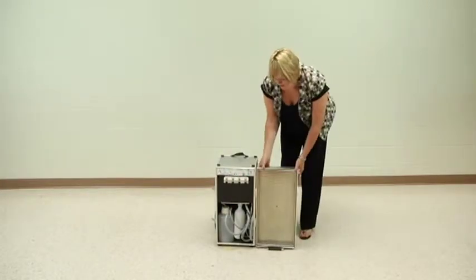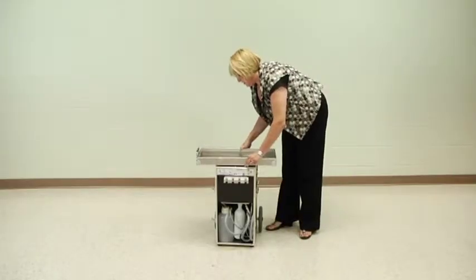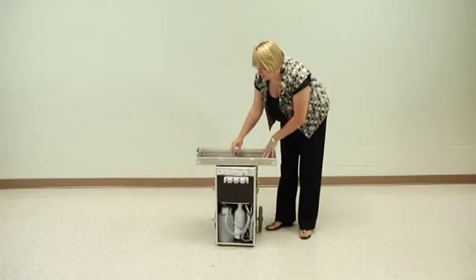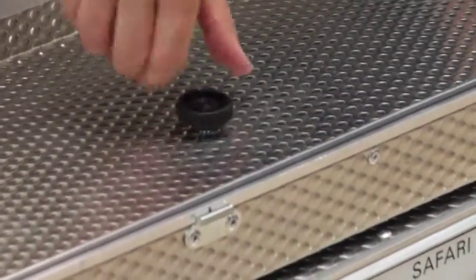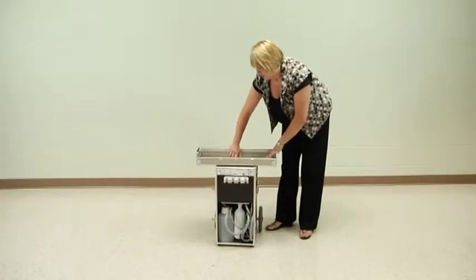The front cover just lifts off of the unit and can then be placed on the top of the unit with the black knob reattaching it, so that it can be used as additional surface for your armamentarium, ultrasonic units, etc.